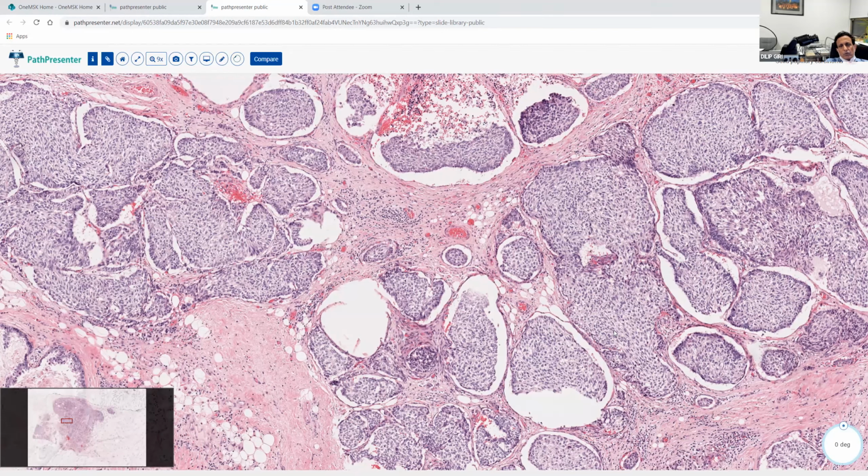Now, again, high-grade encapsulated papillary carcinoma will be rare, right? Because anything that is high-grade will probably have the potential to infiltrate early on in its life cycle. Whereas the low grade will tend not to invade and will just grow in an expansile fashion, like a balloon. It will keep growing and still remain an in situ lesion. But the high-grade ones we don't see commonly because, by the time we see them, they have already become invasive.